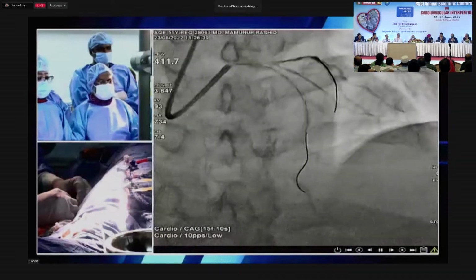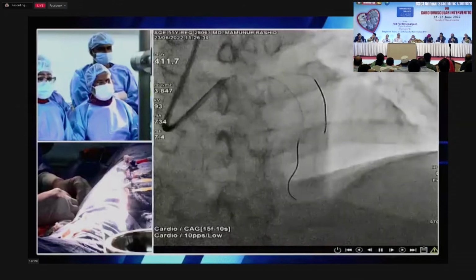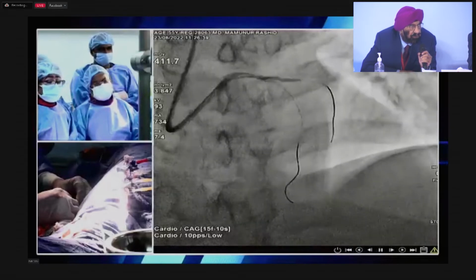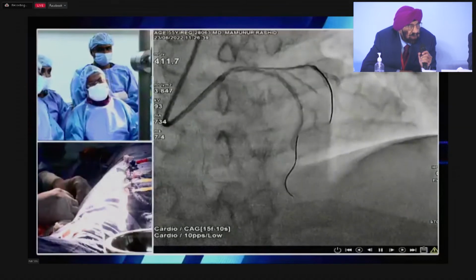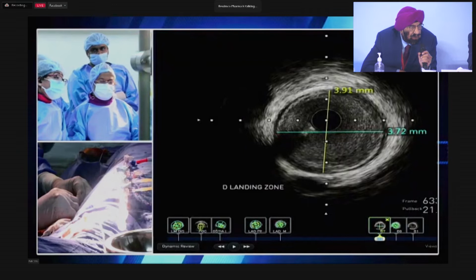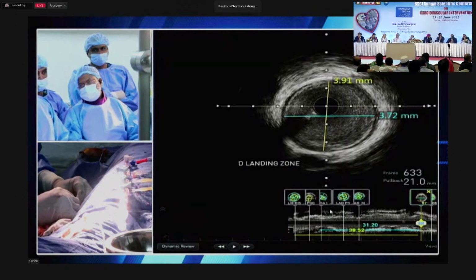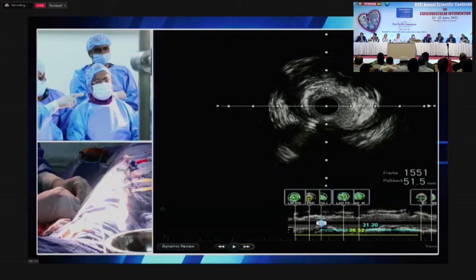Professor Sufia, this is Dr. Gambhir from Delhi. Just one piece of information I would like to know: what is the size of the left main according to IVUS? The diameter is, I think, 5. And what is the length? What is the size of the LAD, where would you start the stent, and what is the size at the ostium of the LAD? Because these three things are very important for deciding the kind of stent.